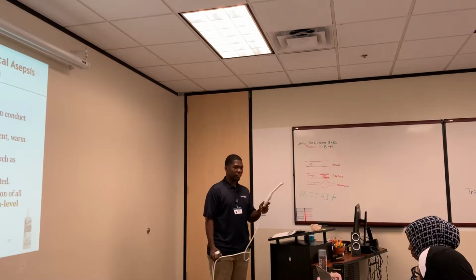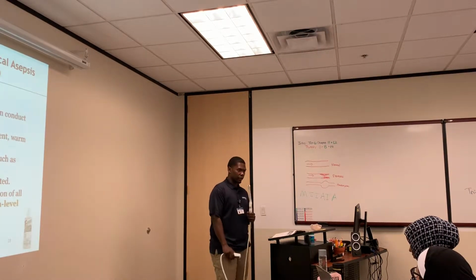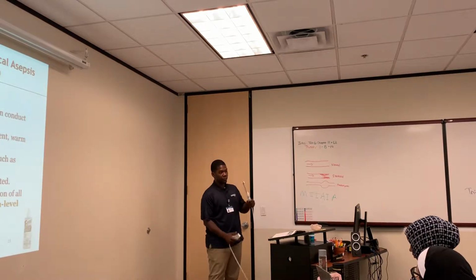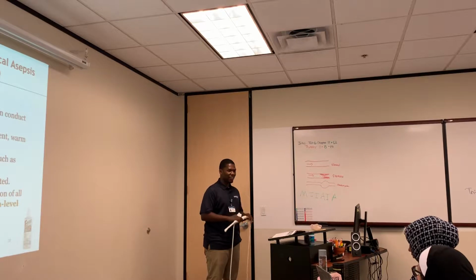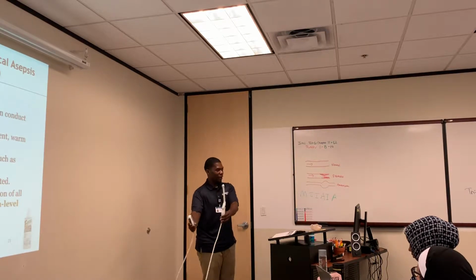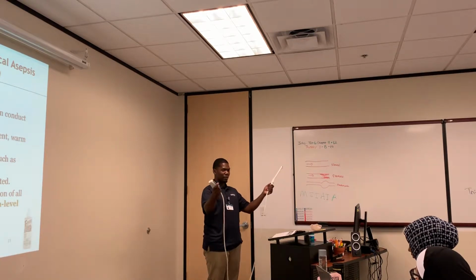We don't want that. So the Cidex solution, we're going to teach you how to use the Cidex solution when we get to clinic, okay? So no worries about the specifics of that. That's going to be one of your main jobs because you're a student. They're always going to be like, here, go clean this probe. Of course, don't just bare hand this probe like I'm doing. You know, it's a clean probe right now.